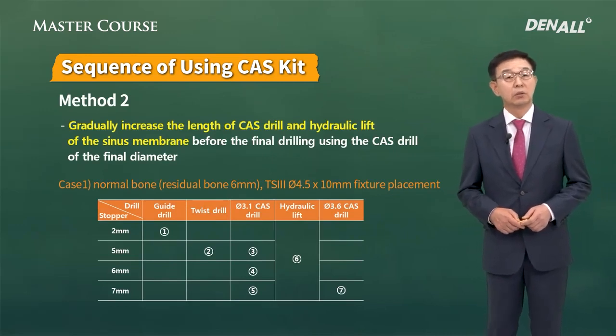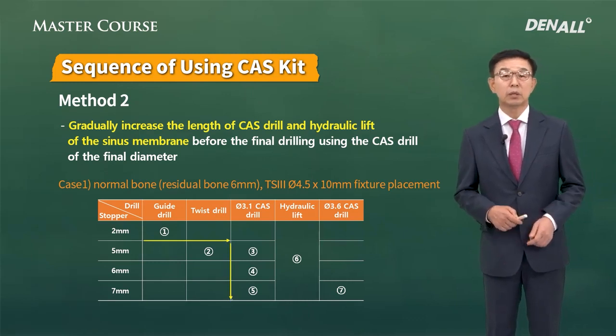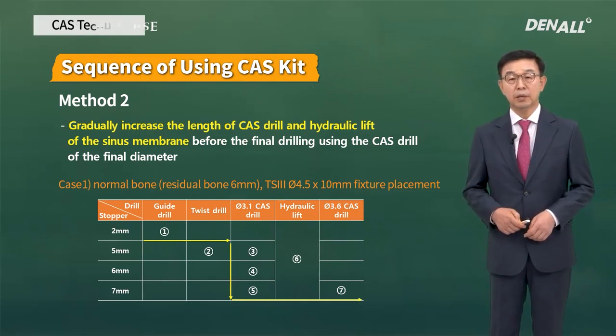Second, you first drill to the desired depths, check whether the sinus floor is penetrated, hydrolift, expand the bone width, and place the implant.